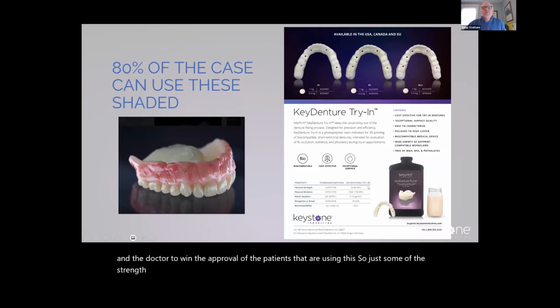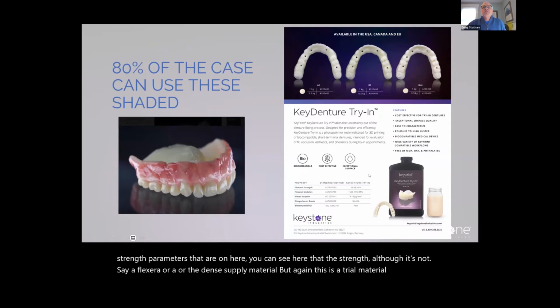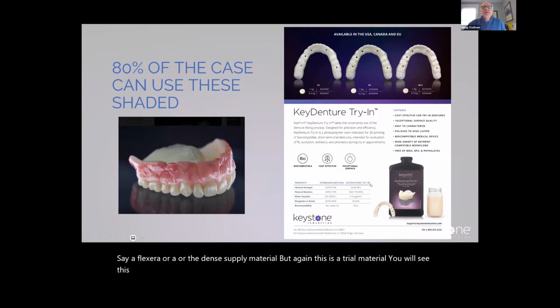So just some of the strength parameters are on here. You can see that the strength, although it's not, say, a Flexera or the Dentsply material, again, this is a try-in material. You will see this material morph into a temporary material once it gets through FDA for that, and then eventually onto a permanent restoration material.